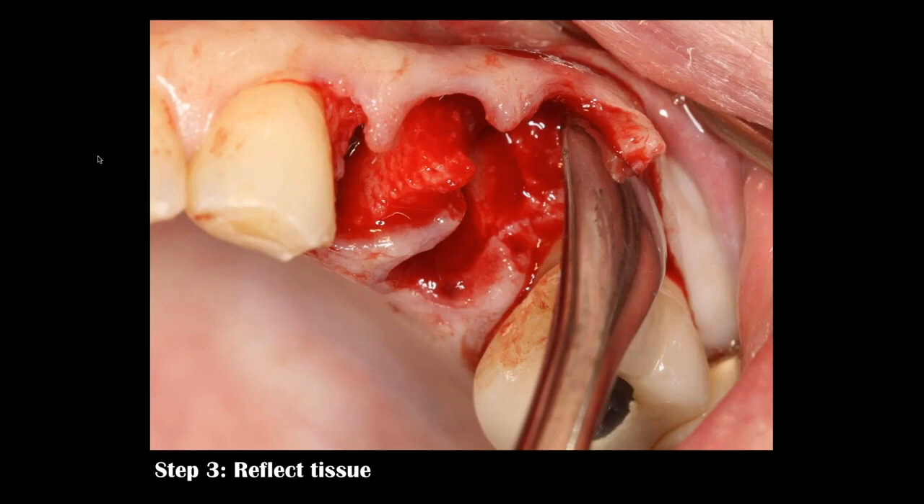The reflection I'm making is referred to as an envelope flap. Visualize a number-10 envelope — a white long envelope. Lift the flap and blow into it. I am not making vertical incisions in my reflections.